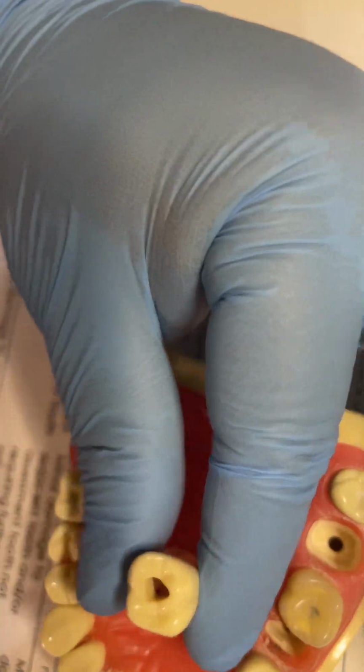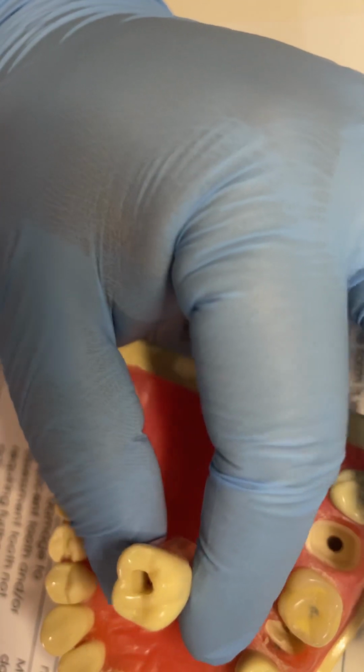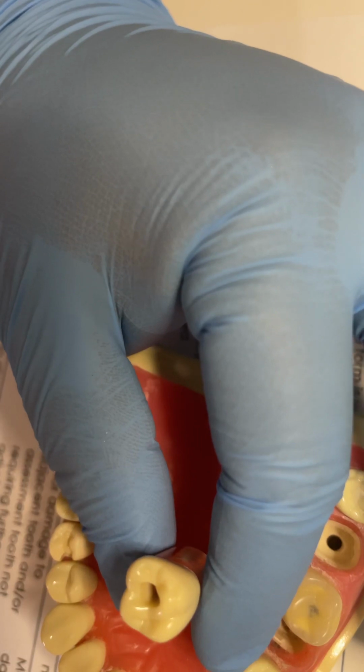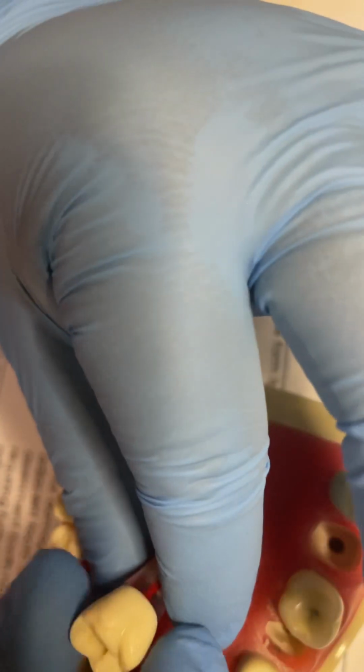Now, the tooth that we buy for practice and the tooth they give for the exam are different. The tooth that we get, the base is transparent, and it has red and inside is also red.